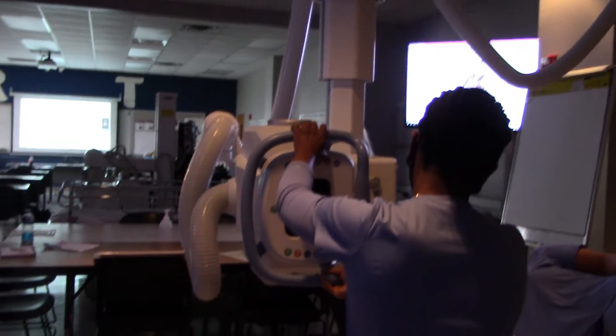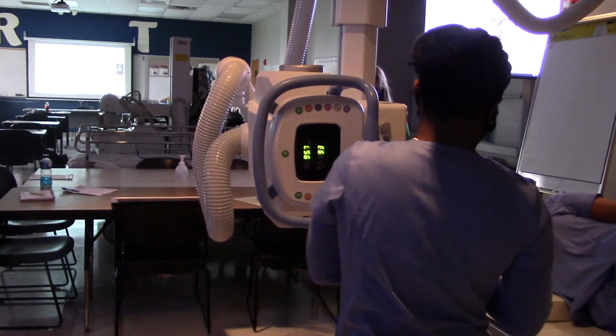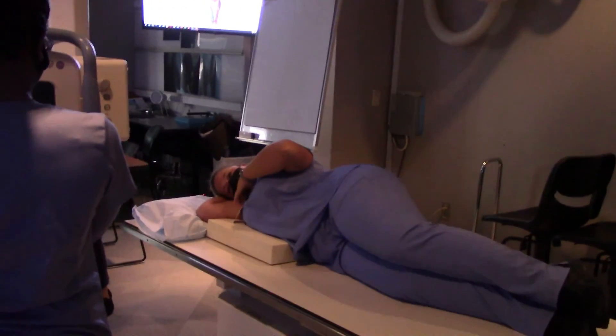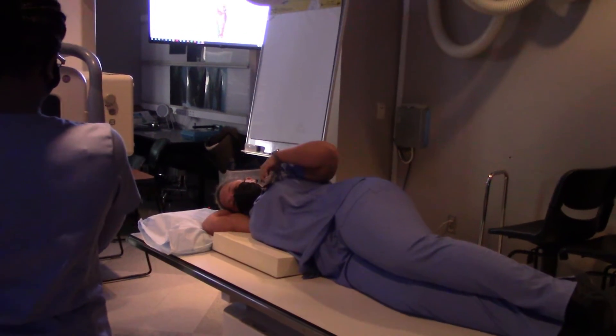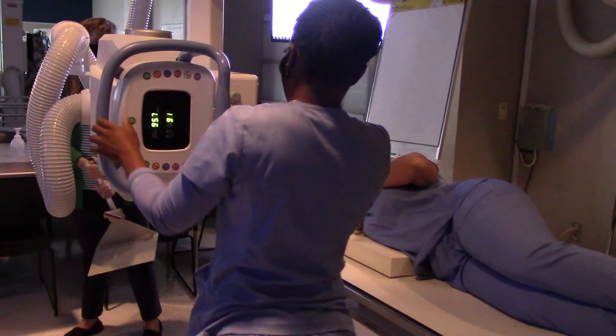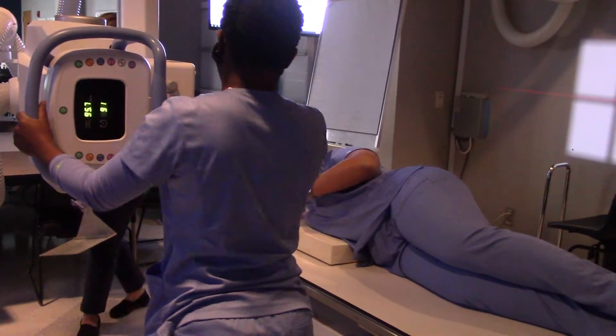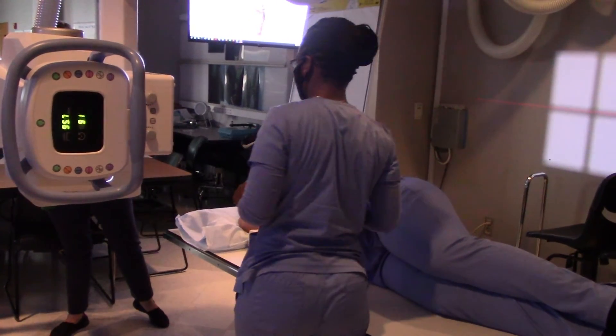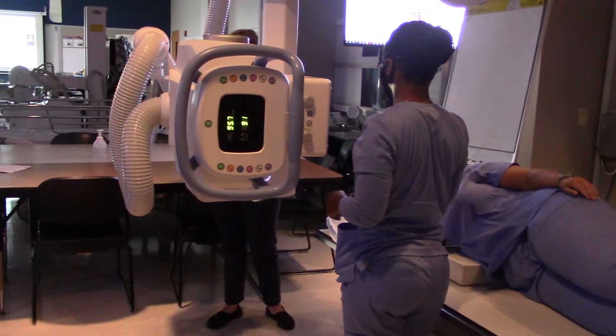Okay, so now we've got the tube oriented correctly — pointing straight across the patient. We're going to need to use that film holder. Now here is a grid holder, a cassette, and a grid.